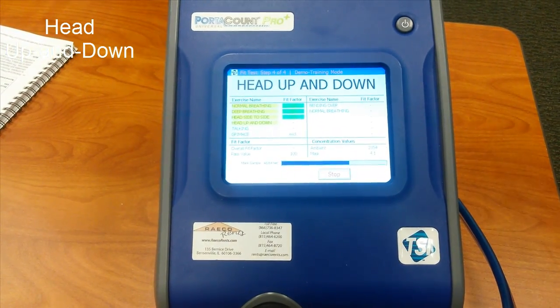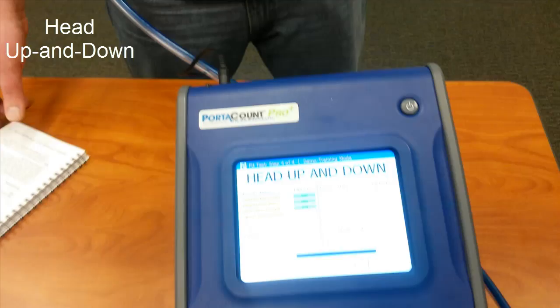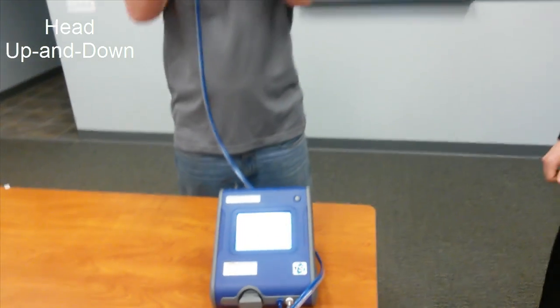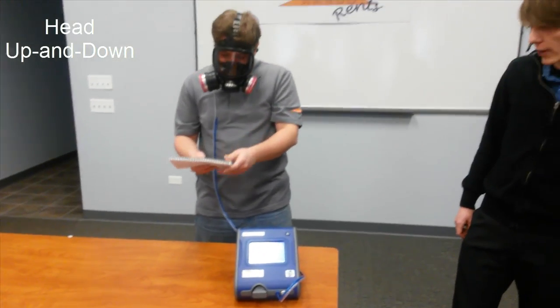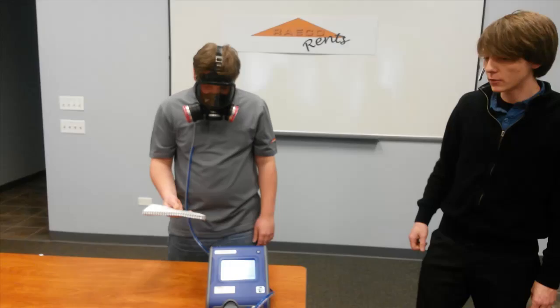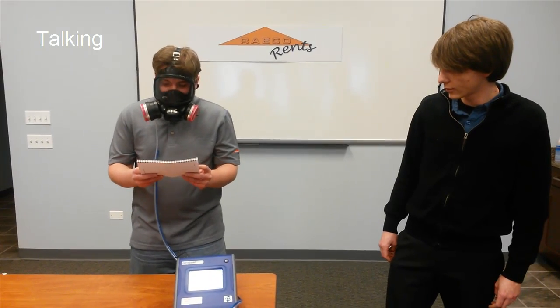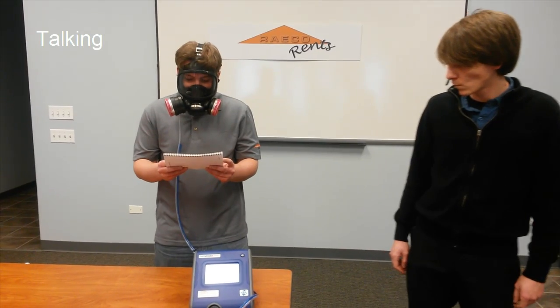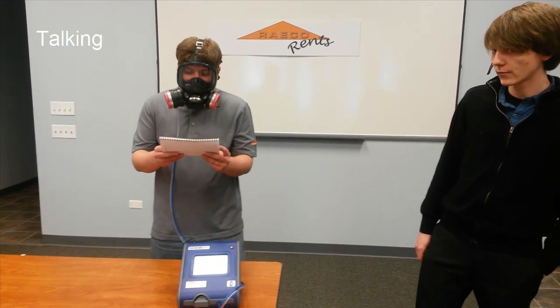After this portion of the test is the talking portion, where they want you to either read from the manual or just speak using a variety of words so that your mouth and jaw move. This is just to make sure that when you're talking and wearing a mask you don't get any leaks. He's just reading the rainbow passage out of the manual.